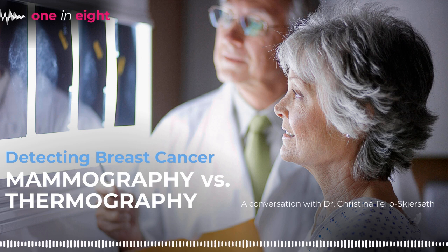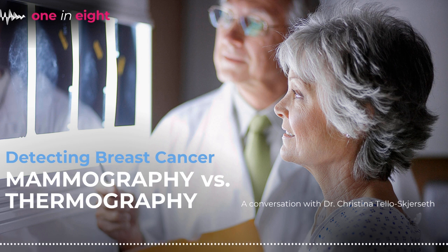I will also say that the FDA does a really good job at watching some of these facilities that offer thermography, and mostly they're going to be medical spas or naturopathic, homeopathic type places, chiropractic care. The FDA watches these facilities pretty closely, and if they advertise thermography as a screening tool with the ability to detect breast cancer, the FDA will send those facilities a letter essentially telling them to cease and desist and to not give out that misinformation to the community. So, we have one here locally that advertises it appropriately, saying that this tool does not detect breast cancer. It's to be used as an adjunct tool. So they're at least advertising it correctly.